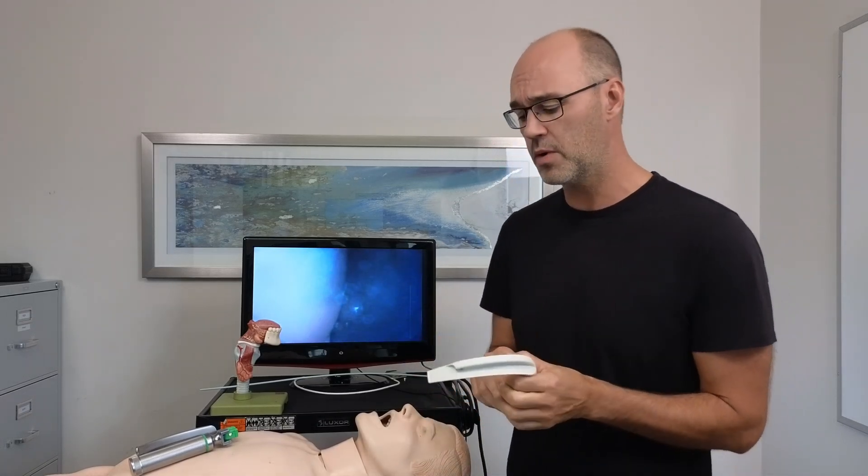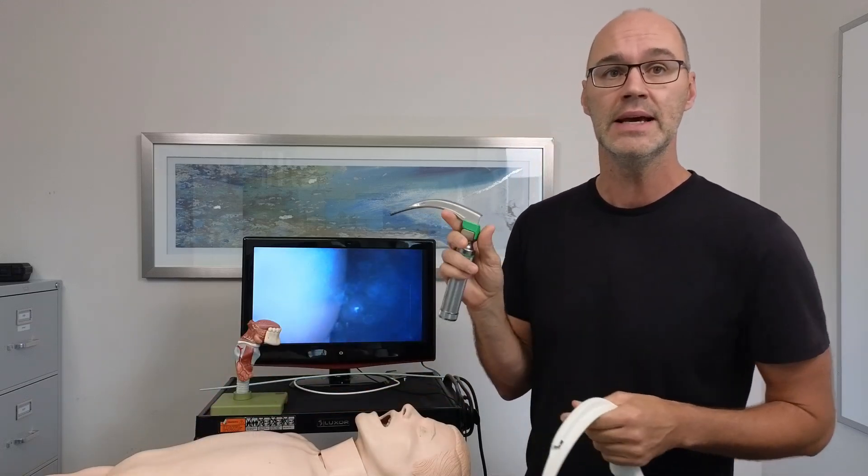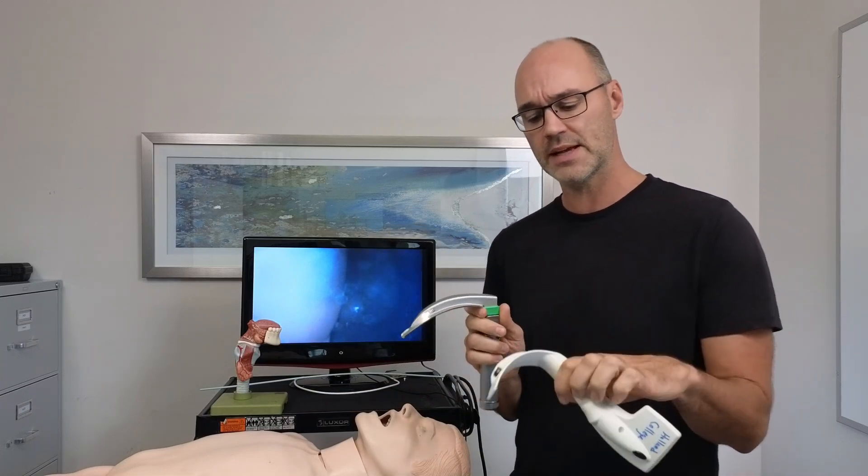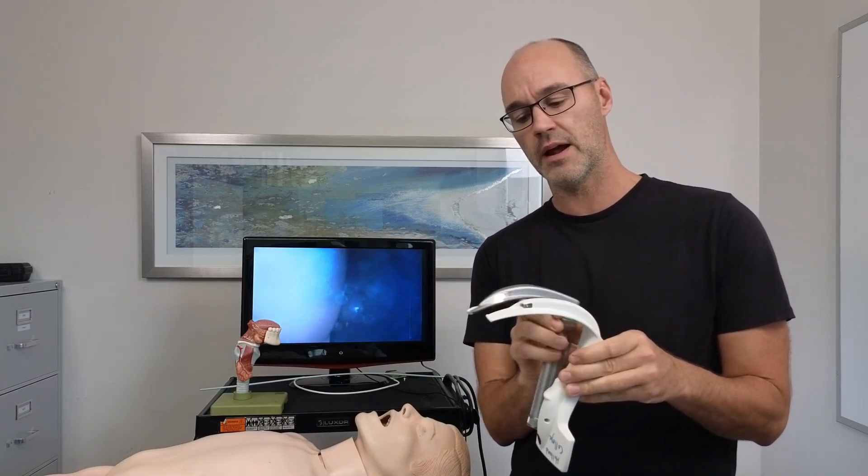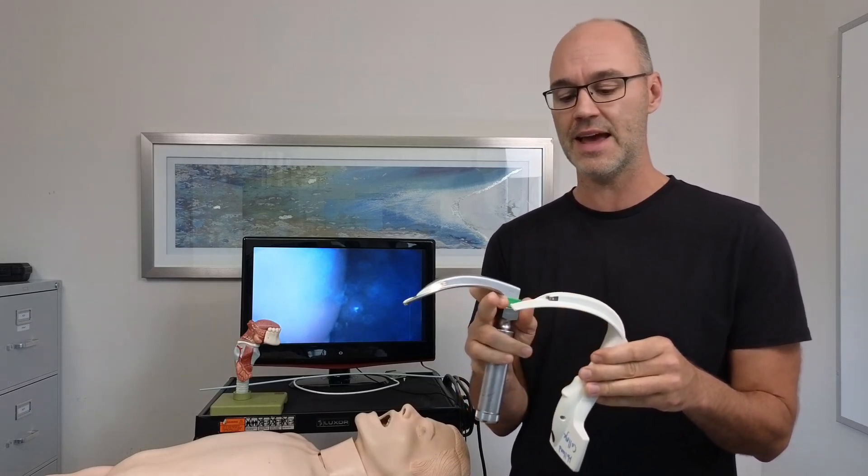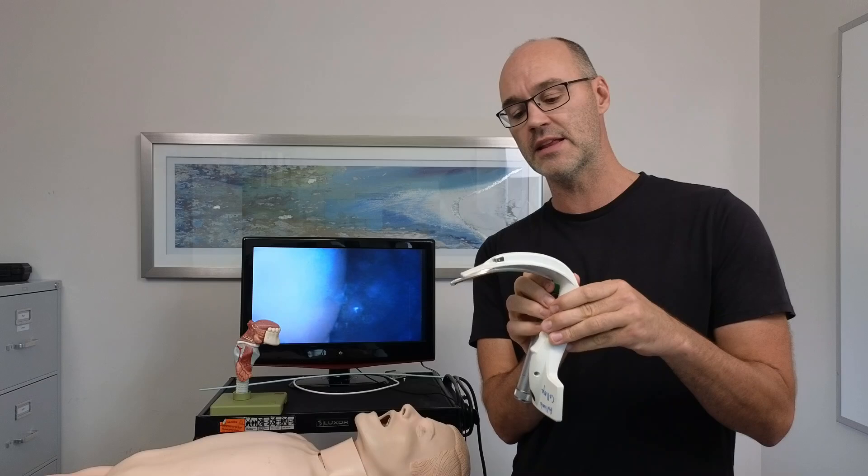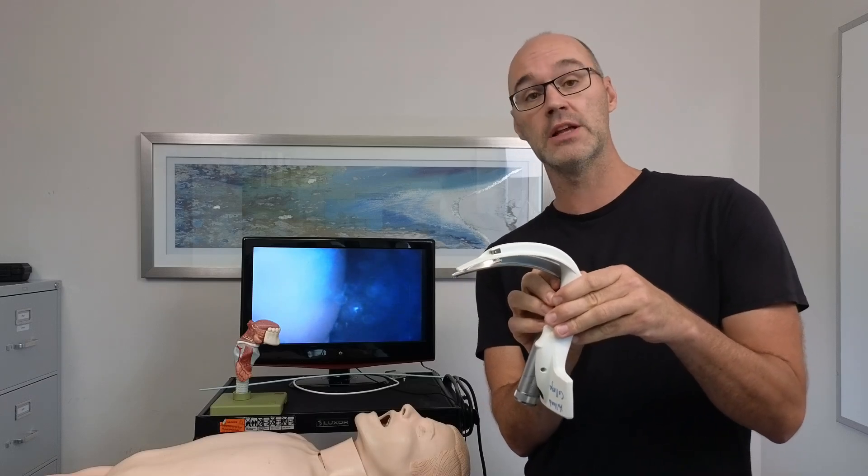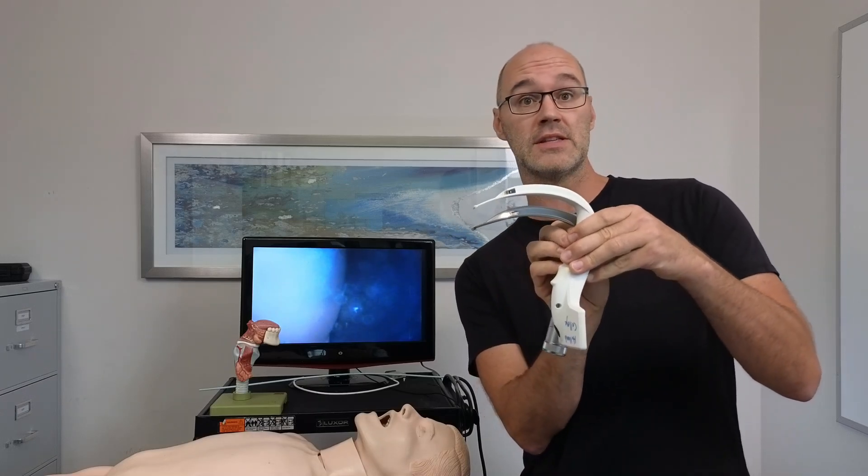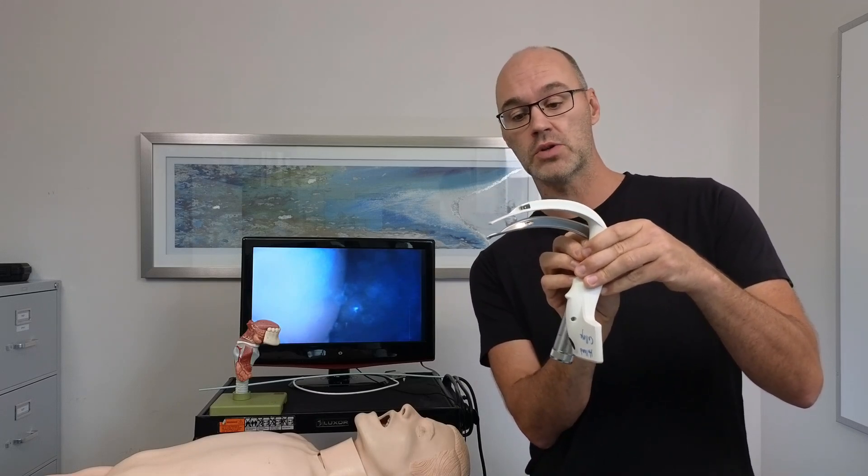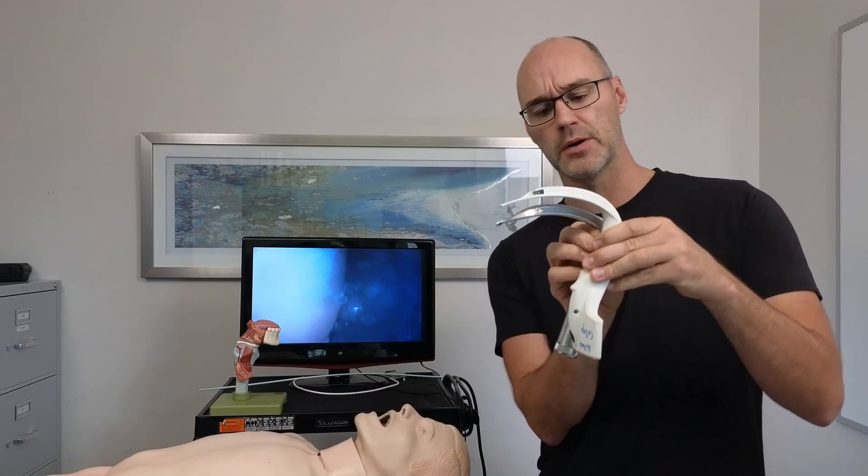When we think of video laryngoscope, we want to think of the difference probably starting off the differences from direct. Indirect with a Macintosh blade. This iView, as we hold it up, and I will be speaking of the business end, the end that goes into the patient's mouth is what we're concerned about. You can see that these are virtually the same angle as far as the ends, where the curve and the approach that that blade will be making is very similar.